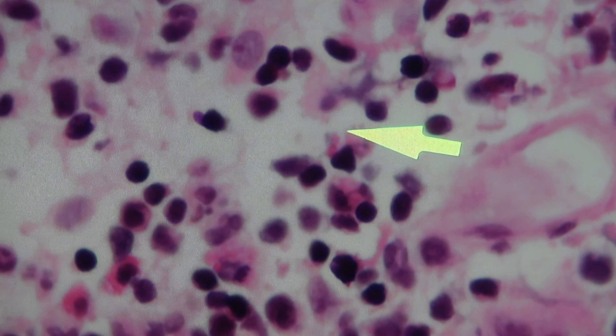We can start to see that this is a medullary inflammatory infiltrate, with two pieces of tissue here. The other is completely medulla — medulla and then corticomedullary junction with an artery, then medulla again — completely uninformative. This piece is the one we started with and much more interesting. There's that inflammatory infiltrate we were looking at before; it is in the medulla, as you can see at the lower power.